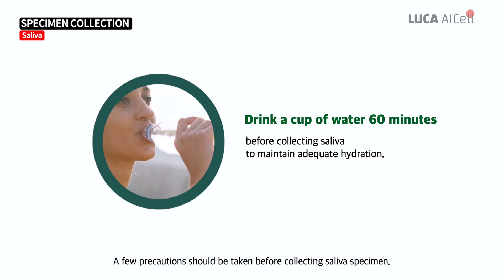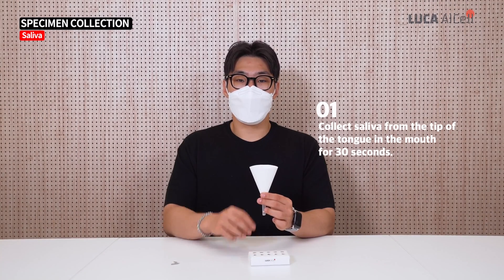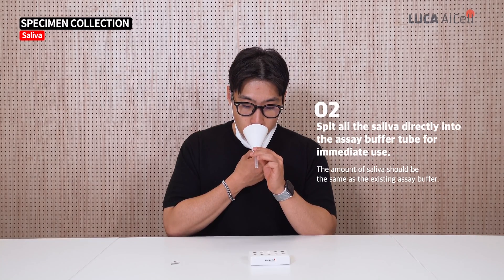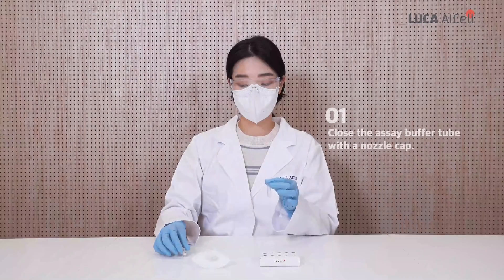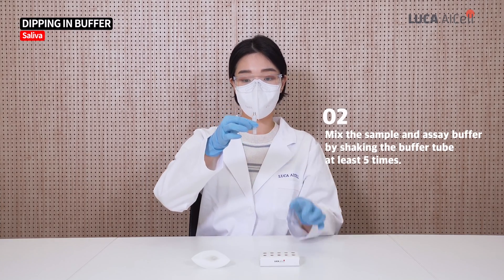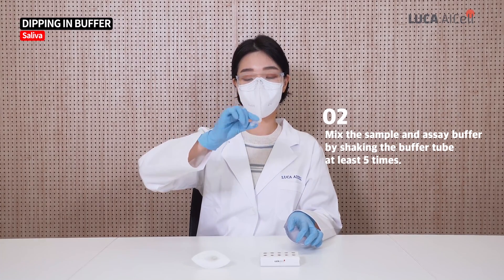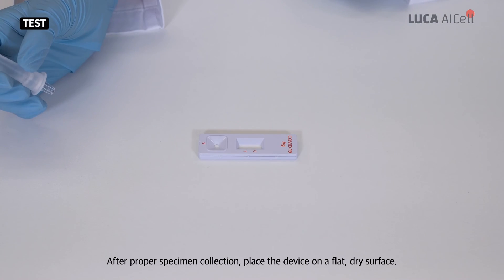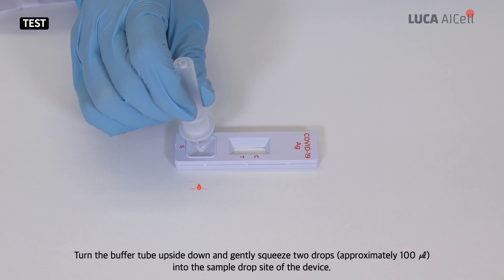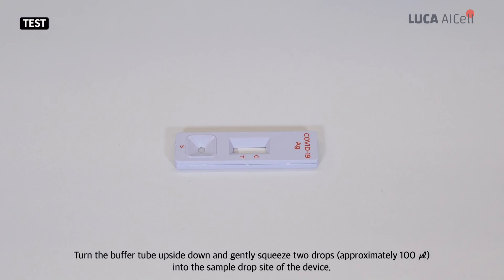A few precautions should be taken before collecting the saliva specimen. After proper specimen collection, place the device on a flat dry surface. Turn the buffer tube upside down and gently squeeze two drops — approximately 100 microliters — into the sample drop site of the device.